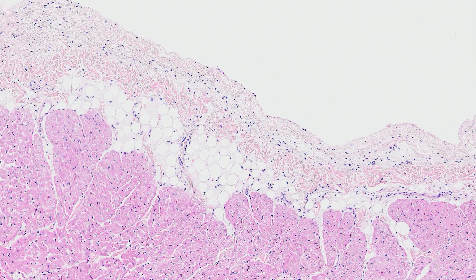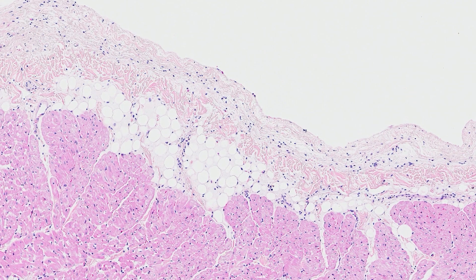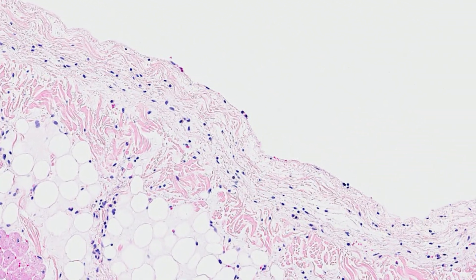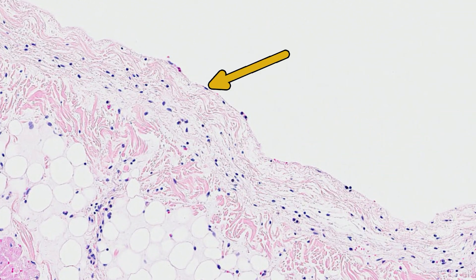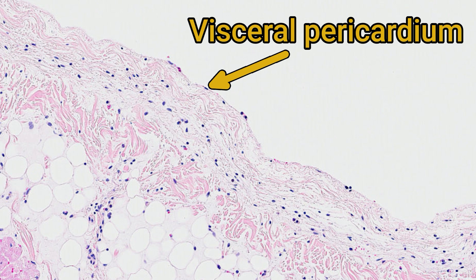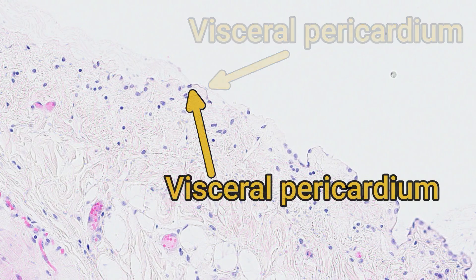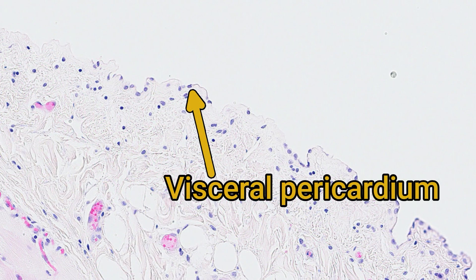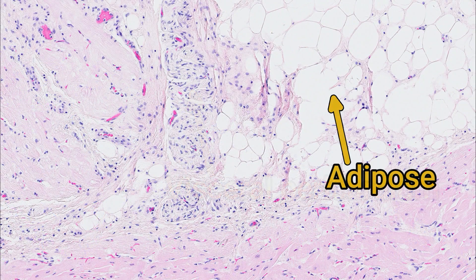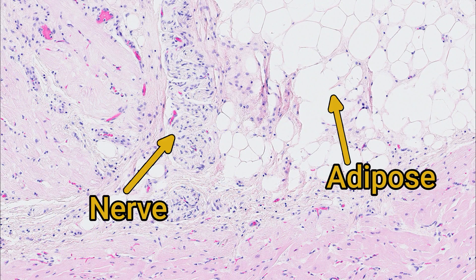When we look closer at the epicardium, you'll see a layer of squamous mesothelial cells covering fibrous tissue. This layer is known as the visceral pericardium. Deeper within the connective tissue, there's lots of adipose tissue, as well as blood vessels of varying sizes, lymphatics and nerves.